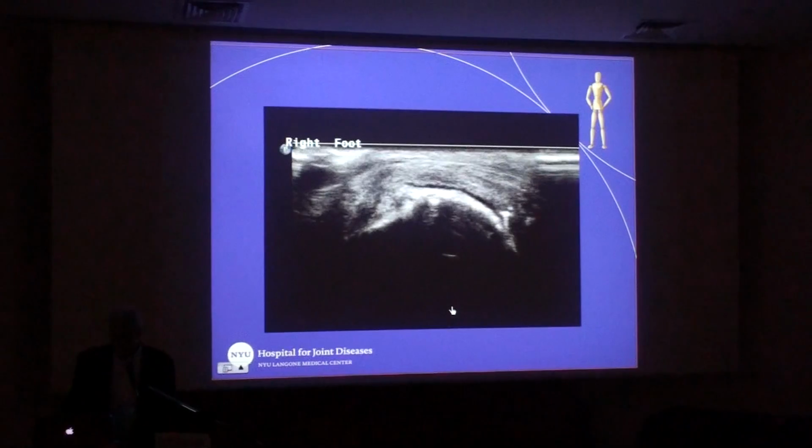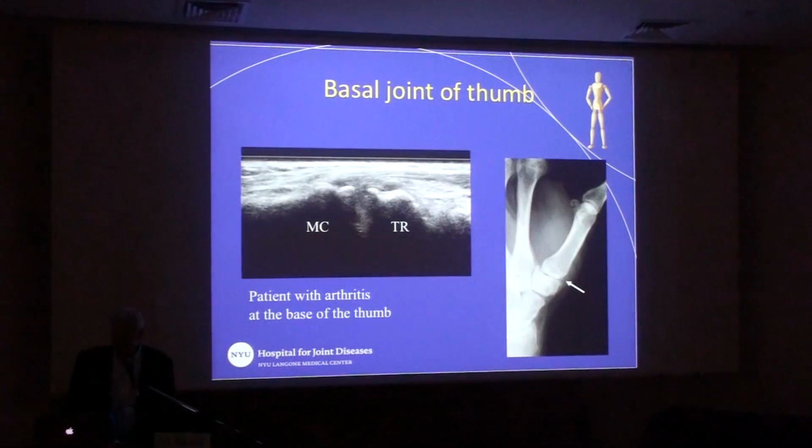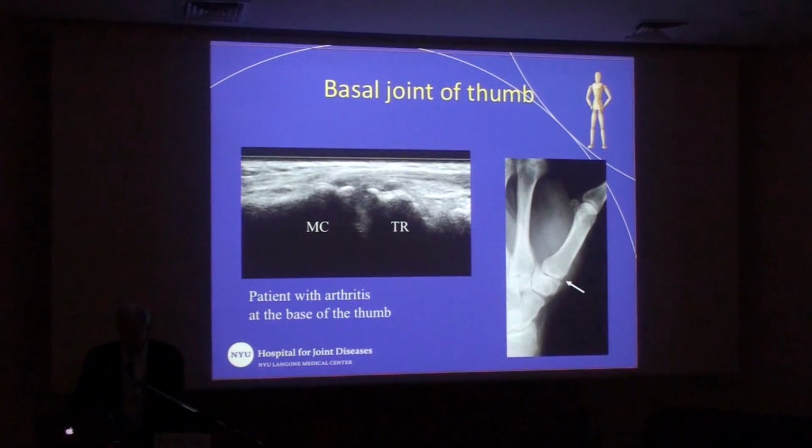No, this one doesn't want to work. Okay. Anyway, here's my needle. Here's my needle cross section, and if the file worked, you would see the extension of the dorsal capsule. So we'll go on. Let's look at another type of small joint injection.